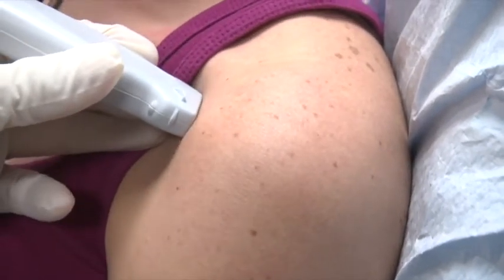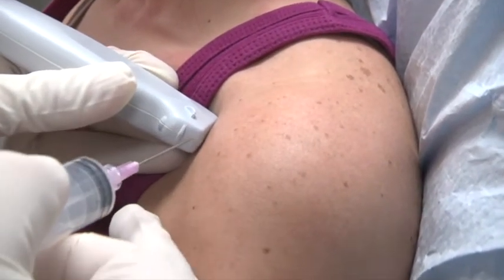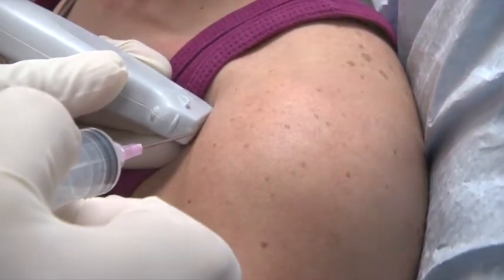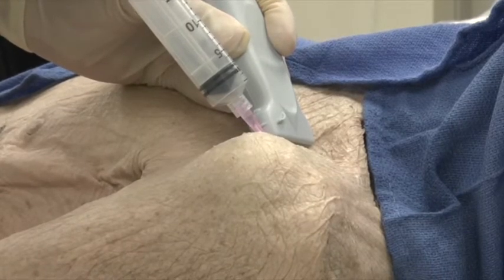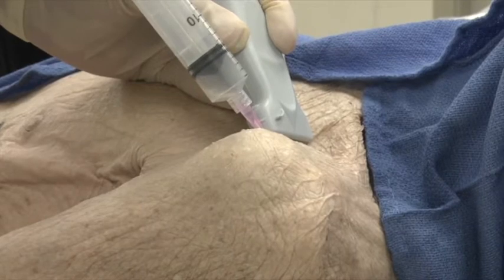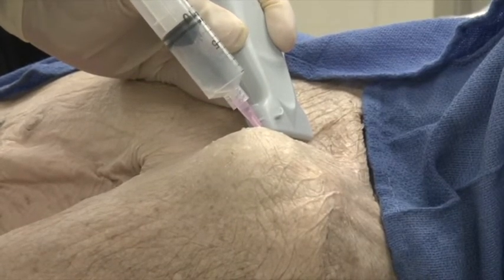Place the ultrasound probe to ensure the target area is visible. Place the needle lateral to the ultrasound probe and proceed medially so you will visualize your needle in plane. Direct the needle toward the effusion and visualize aspiration. Aspirate as much fluid as needed for diagnosis or symptomatic relief. Remove the needle and place a clean dressing.